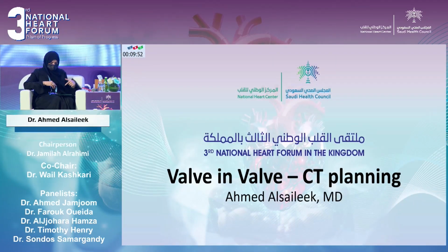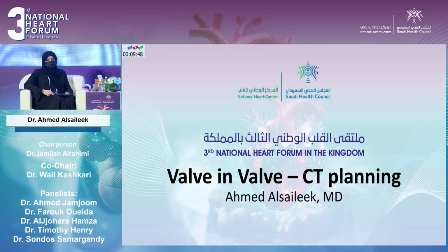Okay. So there are a lot of similarities between valve-in-valve and native valve TAVI, but I'm going to focus mostly on the valve-in-valve.